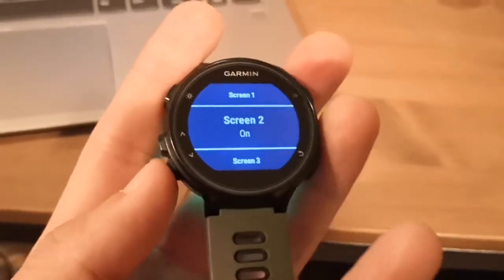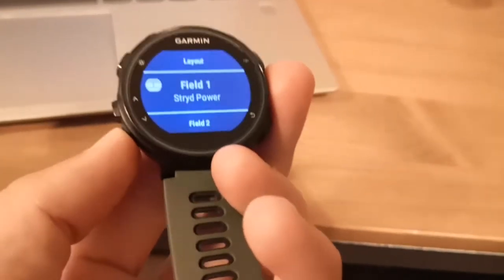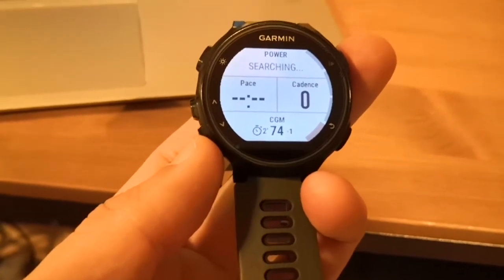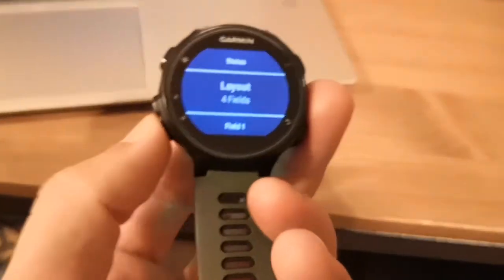Let's look at screen two. I've got a four-field layout. I've got Stryd, which is my running power, and I've got my CGM at the bottom, which is instantly hooked up to my phone. You'll notice there's a timer on the left showing how many minutes since the last reading, and a small figure on the right — currently minus one — which is the difference from the last reading. The big number in the middle is the actual glucose reading.